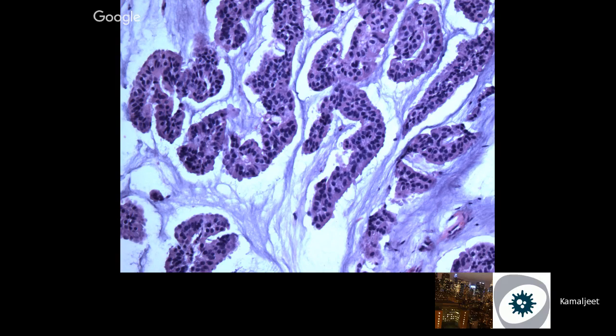So what is recommended by CAP in the guidelines is, if you're looking at a micropapillary and you are about to call it 1+, and it is basolateral staining, reflex it to FISH. So it's written in the guidelines. So it's important to identify this variant and think about it when you're doing the HER2 assay. What's the marker you stained in the previous IHC? That's the epithelial membrane antigen. EMA. Yep.